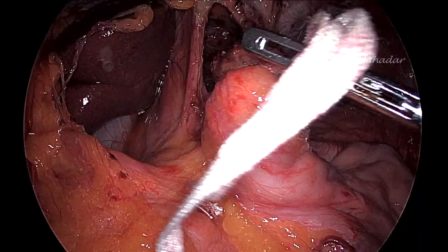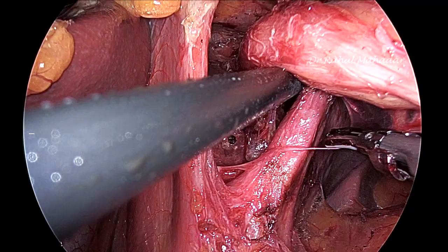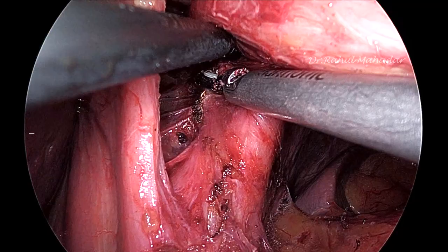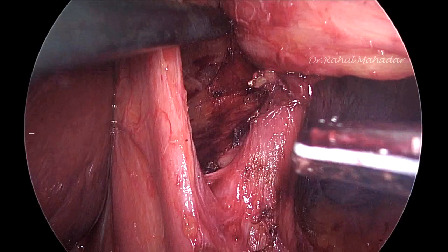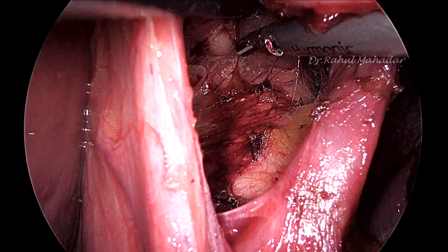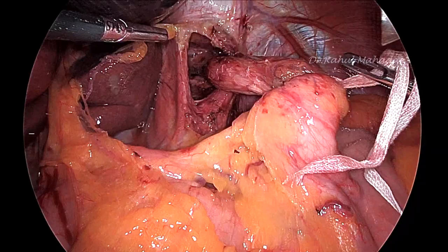So now you have to judge how much intra-abdominal esophagus length is achieved. Still some attachments are there posteriorly that need to be cut. So with the help of a harmonic scalpel, you can cut these fibers and complete the dissection from the posterior side. All these attachments are flimsy, but small vessels are always there. So try to avoid bleeding. Now you can see with traction how much esophagus you have mobilized.